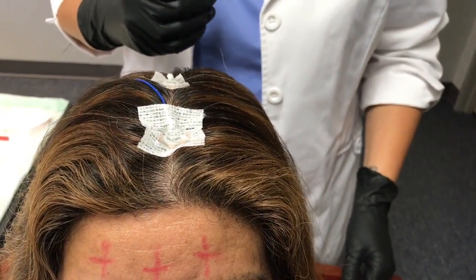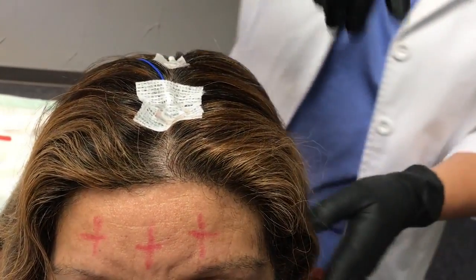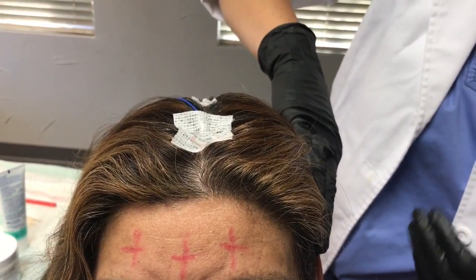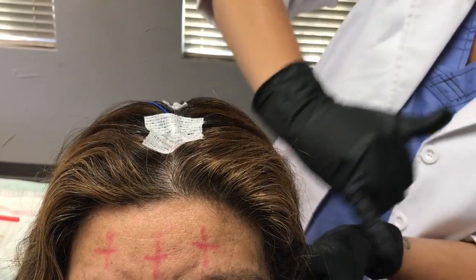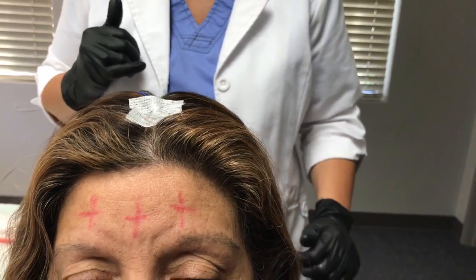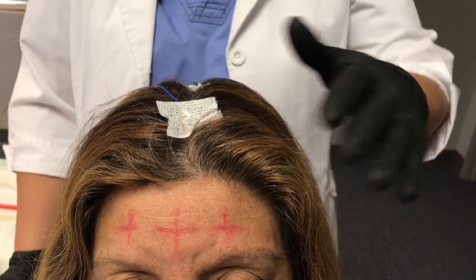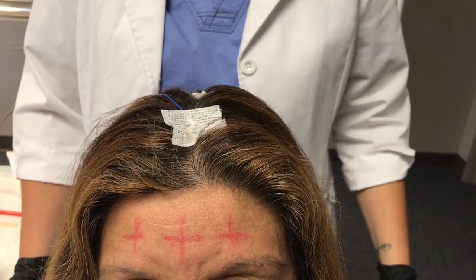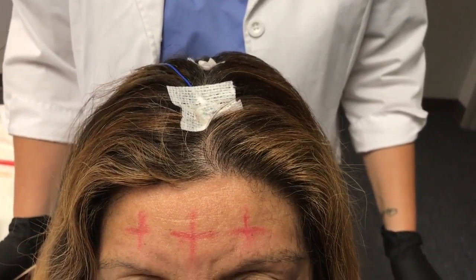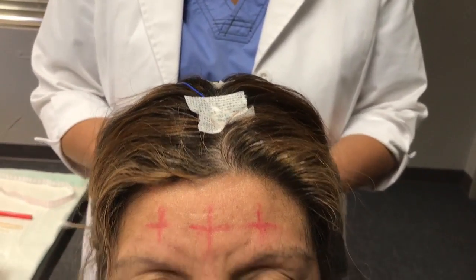This holds true for applying A1, A2, M1, and M2 on the mastoid behind the ear. In these locations, especially A1 and A2, if you place an electrode with the tail of the wire pointing down, it can pull off easily. I recommend applying the electrode with the tail pointing up or toward the back of the head. You may use EEG cup electrodes or the genuine Grass reusable ear clip electrodes. Now let's take a look at applying the EEG electrodes on the frontal region of the head, FP1 and FP2. Skin preparation and application is the same as previously described. The only difference is that tape would be a superior application method versus gauze, particularly due to the bare skin. This also applies to other areas where there is no hair, such as A1, A2, M1, and M2.